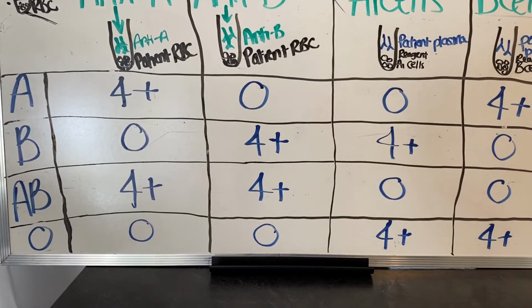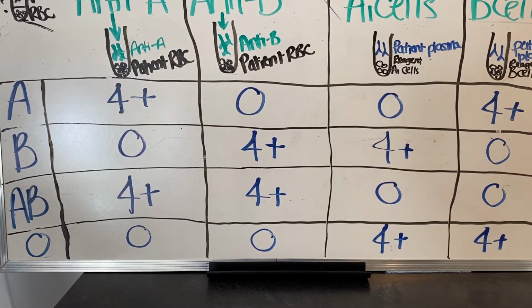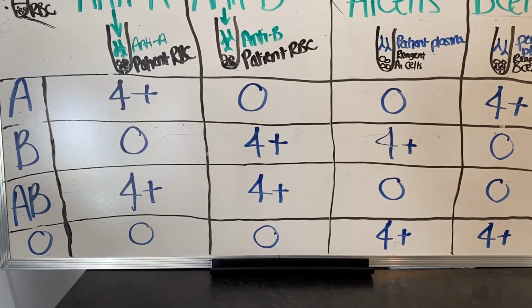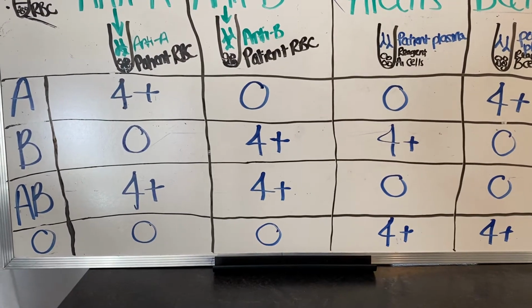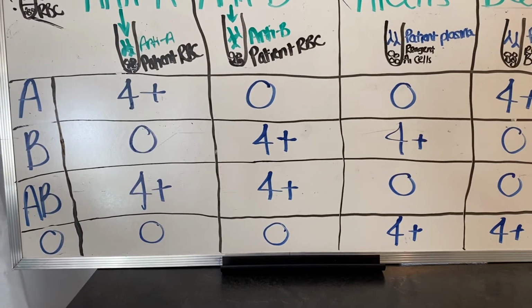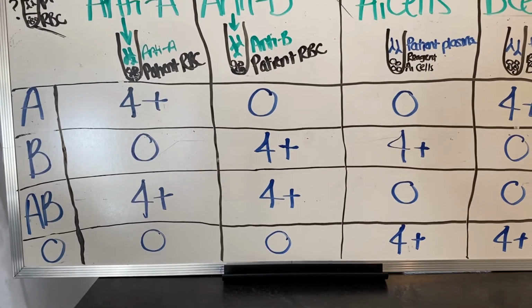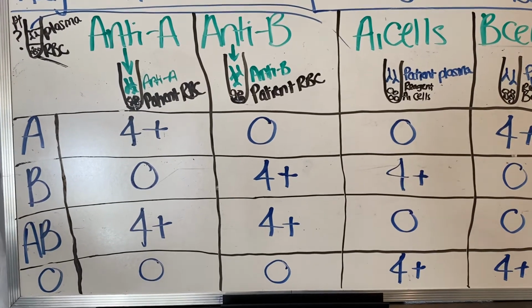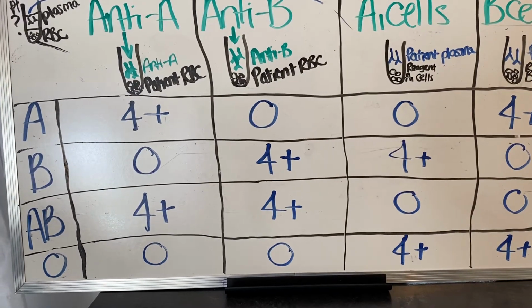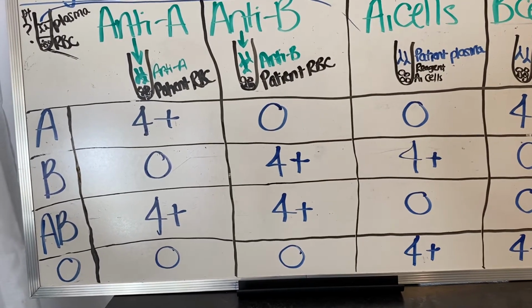And that is really important to determine, because if they have an anti-H in their plasma and you were to cross-match them, like give them group O blood because you're assuming they're group O, right? If they're Bombay, they can't produce any antigens, so they appear to be group O. I just told you, how do we determine a group O person? Well, if they don't react with anti-A and they don't react with anti-B, they must be group O. And we don't confirm with anti-H with all of them. But technically, a Bombay individual will present the phenotype of group O. That's the phenotype that they're going to present.